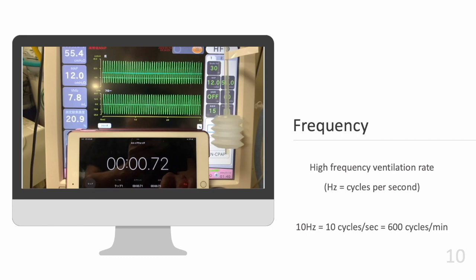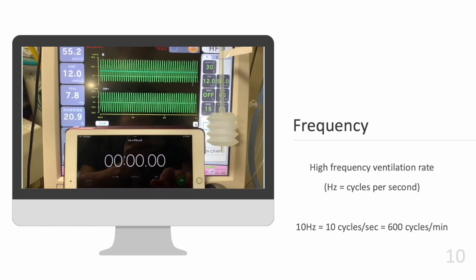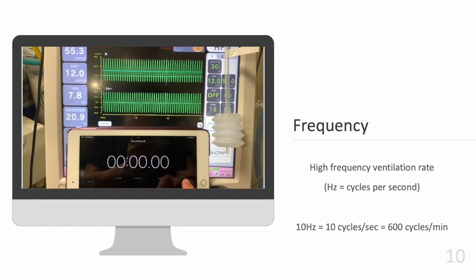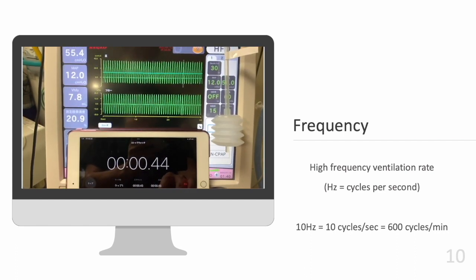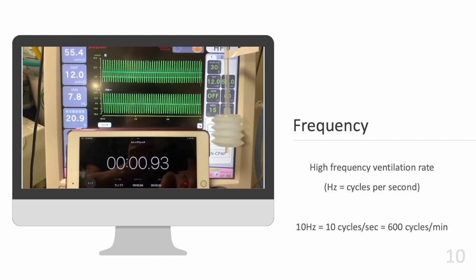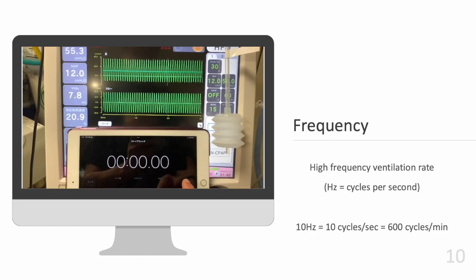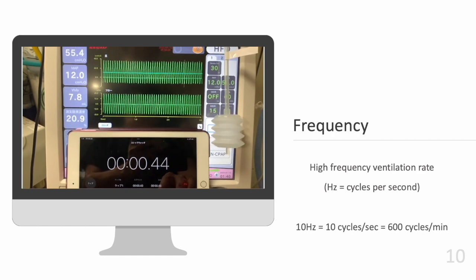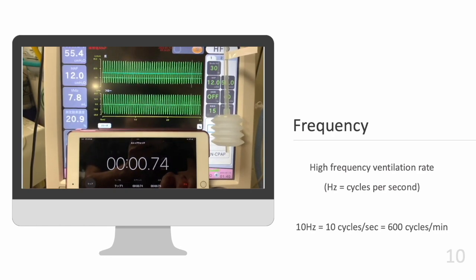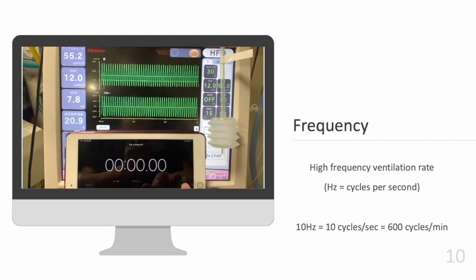I actually checked it in slow motion. The ventilator was set to 15 Hz. The test result shows that the test lung moved 15 times per second as per the 15 Hz setting. Ready? 1, 2, 3, 4, 5, 6, 7, 8, 9, 10, 11, 12, 13, 14, 15. That's it.